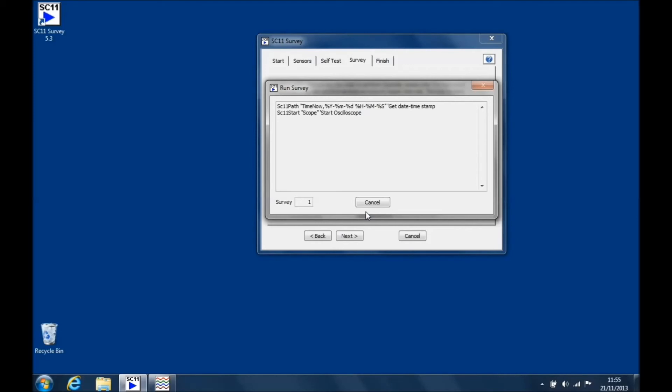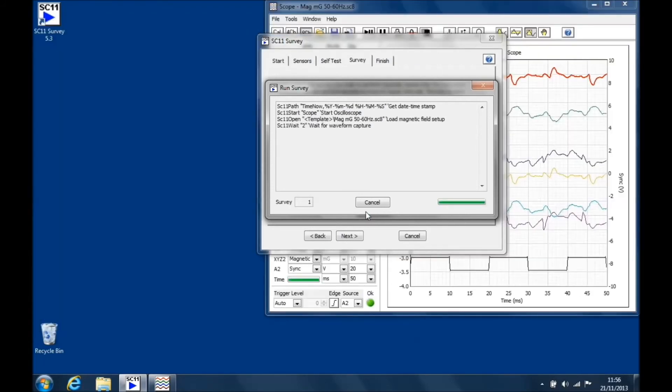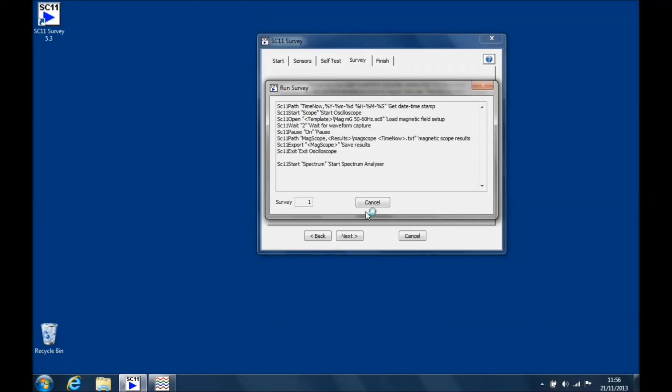The macro for this survey will then start to run. It calls up the other programs which are part of the SC11 analysis system package to take measurements and make a report from all the data acquired. Here is another speeded up sequence of the survey running.